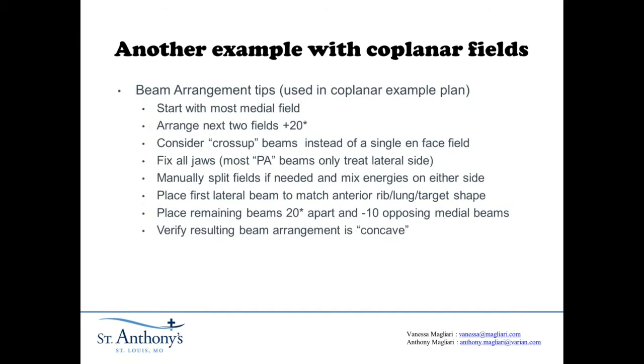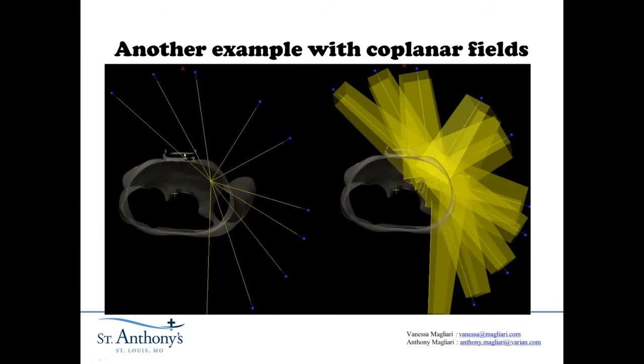Here's a picture of exactly what I'm talking about. Here are the first three beams that are 20 degrees apart. These two are the cross-up beams — this beam actually treats this side of the breast, and this beam treats this side. You can see where they almost cross. Then this is the lateral beam that defines the edge of the target. The last beams split the difference between these entrance beams, and then we move down and have a PA beam to create this concave beam arrangement.